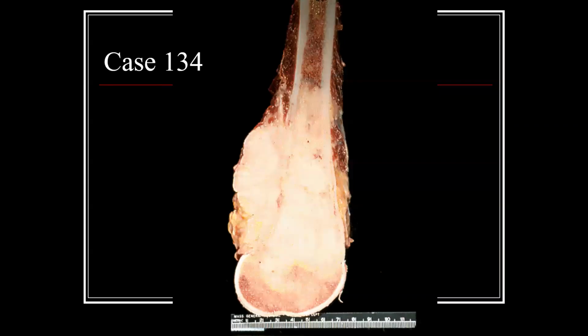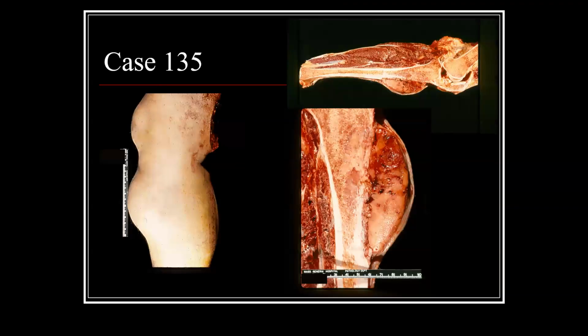We won't pay a lot of attention to the distal femur there, but that corresponds to what was seen here, where you see this very dense osteoblastic process going on with obviously a soft tissue mass and destruction of the cortex. And then we see how these can extend proximally. So you want to make sure when you're evaluating these that you get a good view of that as well.